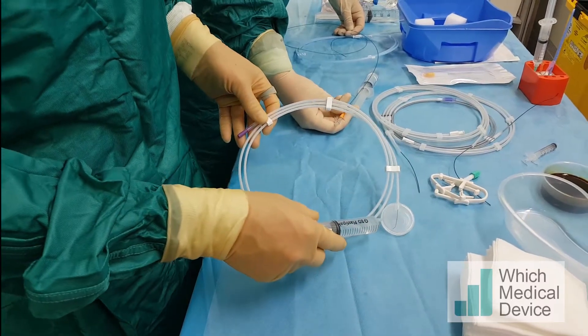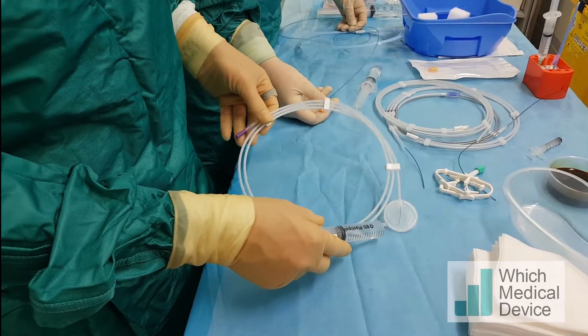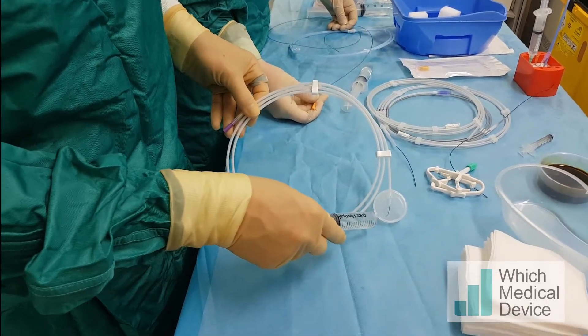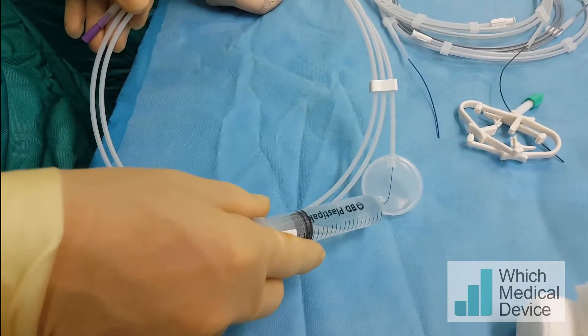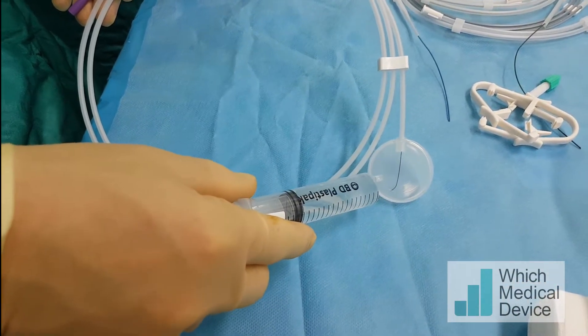This is the 016 Meister guide wire by Asahi, which you can see has a short angled tip and is said to have very good torque ability. This is what we're going to try and use across this stricture.